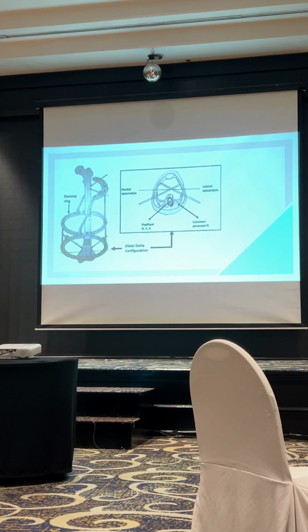This is a simple diagram to show if, let's say, you are doing Ilizarov for a femur. So it is less forgiving for a femur because, like what was shown before, a good amount of ring you can apply on the distal femur. Because of the larger surface area, you can apply for about 270 degrees around the distal femur. But if you go a bit more proximal, you can probably apply pins from anterior to about halfway through the posterior side of the femur. But on the medial side, hardly any pins can be put.